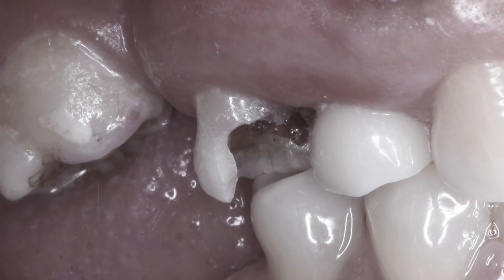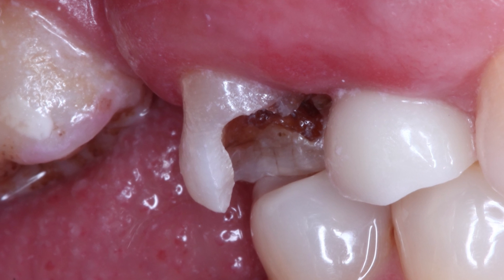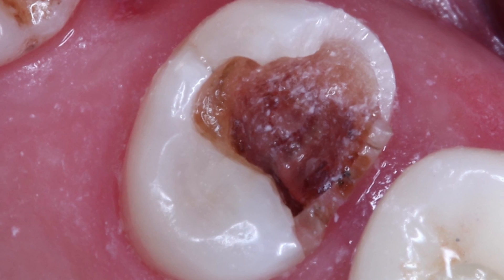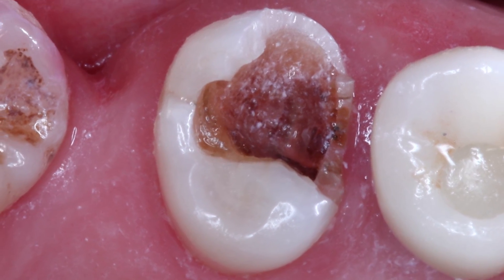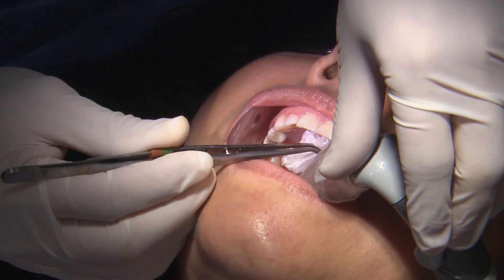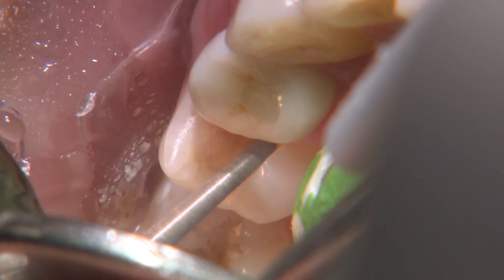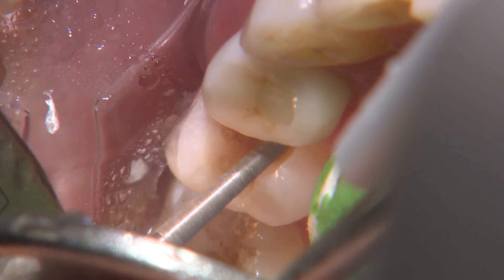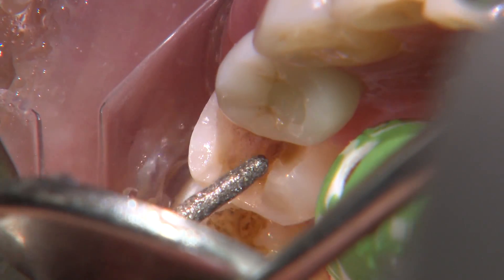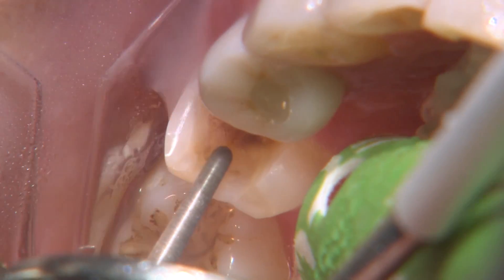We have a 53-year-old female that presents with extensive decay on tooth number four. The previous MO amalgam restoration has fallen out due to the weakened tooth structure. The treatment plan is to remove the decay and determine the restorability of the tooth once we reach healthy, sound tooth structure. From there, if everything looks good, we'll plan to mill a chair-side restoration.